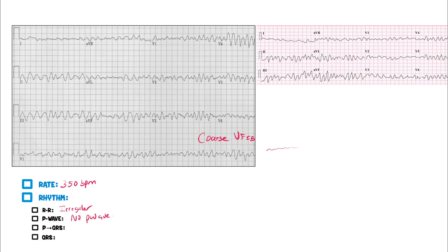It's really inconsistent. There's no P wave, we don't even have to worry about that. And if there's no P wave, there's definitely not going to be an association between the SA node, AV node, bundle of His, bundle branches, Purkinje. So there is AV dissociation here. QRS complexes, they're wide, they're definitely wide. You're going to see that they're greater than three boxes, no doubt about it.